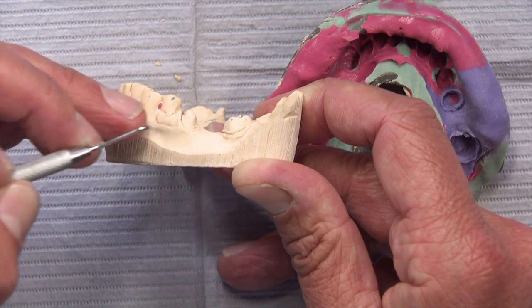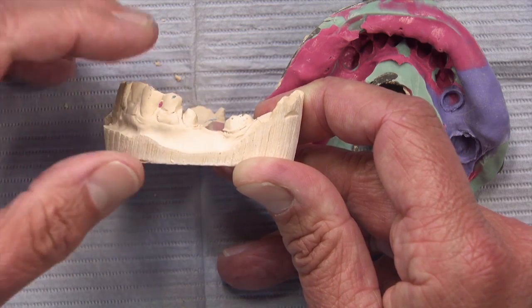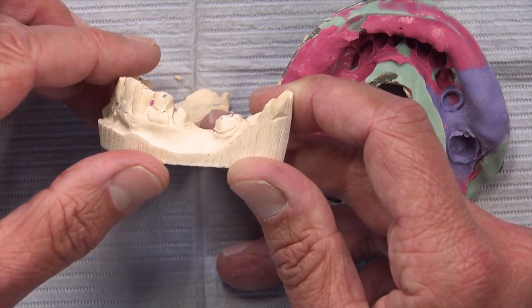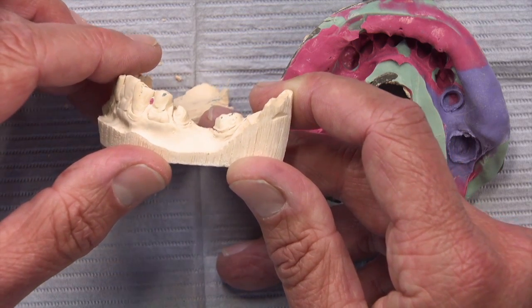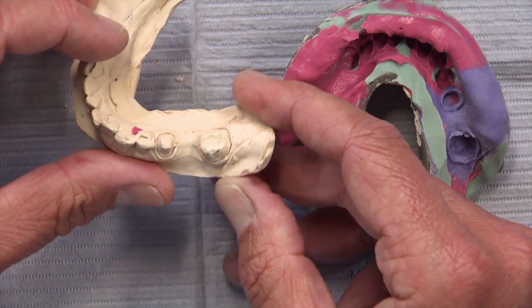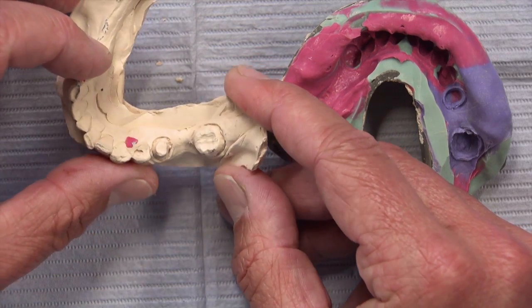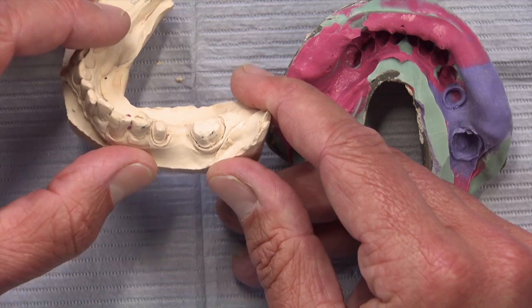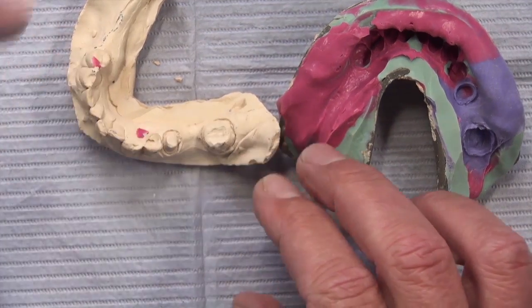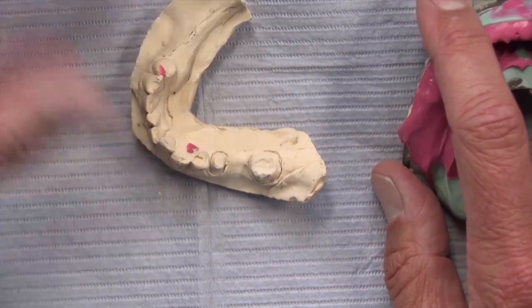Doing things like diode lasers and the AquaCell cordless are ways to get away from packing cord all the time. I do still pack cord in the anterior, and honestly a lot of times in the posterior too, because it's part of my prep technique. My assistant is an RDA with extended functions, and here in California she can pack cord, take the whole impression on her own, and even cement the crown. I understand wanting to get away from laborious cord packing, but not at the expense of crowns that fit too tight and occlusion that's thrown off — there's got to be a better way.